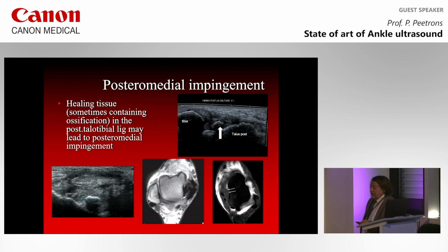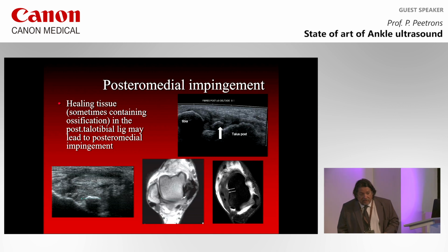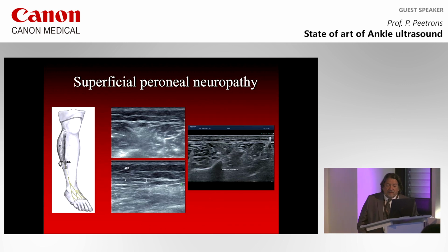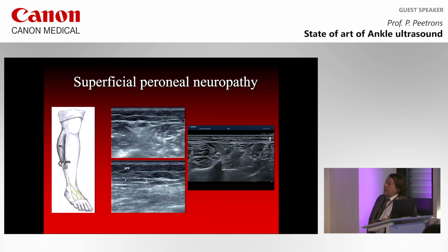And then the pain can tell you that he has an inversion pain. When he does inversion, which is in fact supination of the foot, you can see he can have some pain in this part.